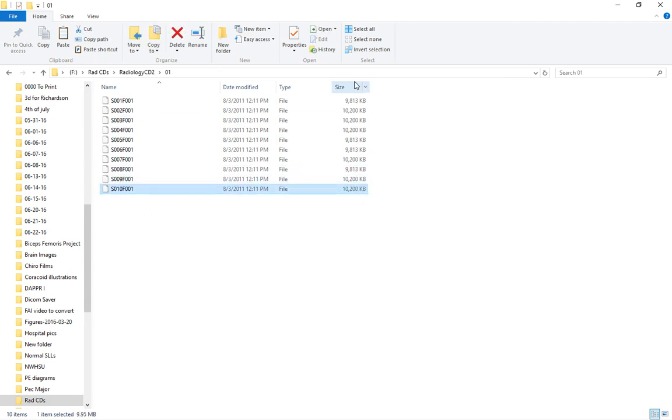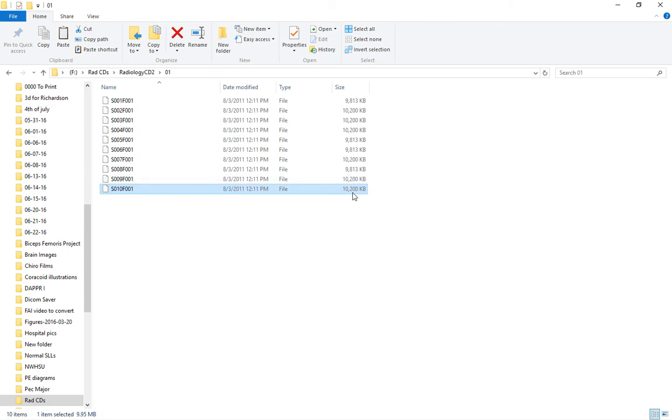But because they're large files, most file servers or email servers won't let you upload more than 20 to 25 megabytes per email, so you only get two per email. The easiest solution is just to create a zip folder with all the files in it.